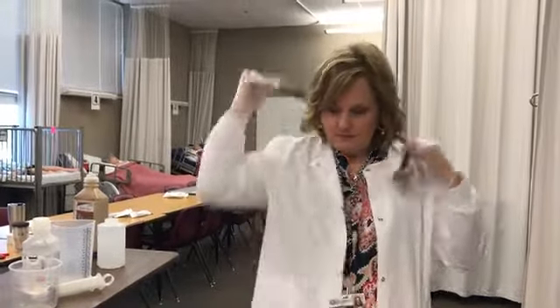The next thing that you'll want to do is assess for bowel sounds. So you can don your gloves. When you assess for bowel sounds, you'll want to assess in all 4 quadrants, and you'll also want to put the stethoscope to the skin of the client.